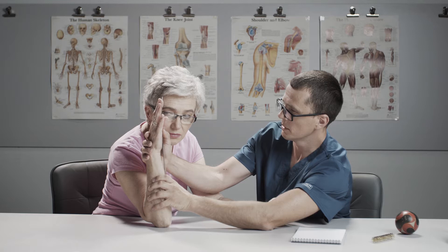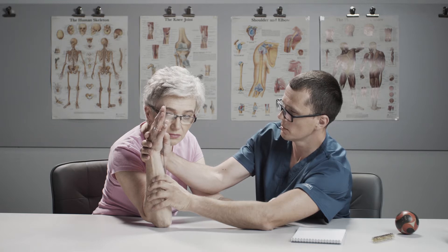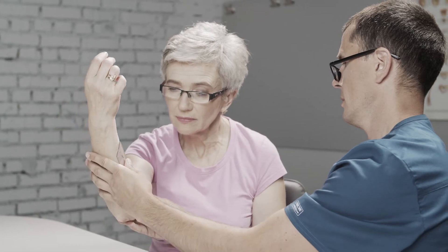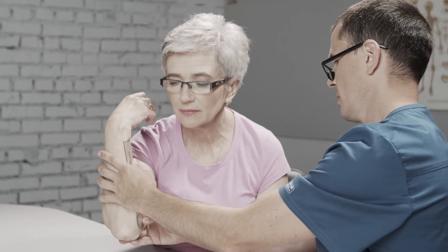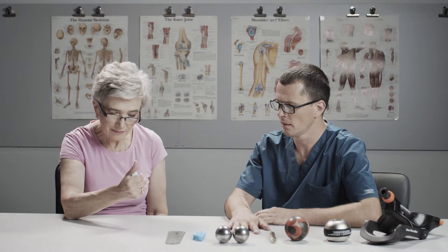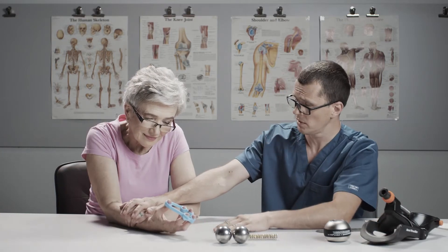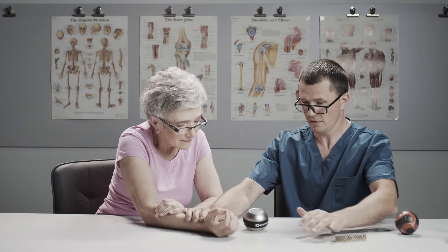The rehabilitation process can be very long and demotivating for both the patients and therapists. Endless manual examination tests, boring repetitive exercises, and uncontrolled rehabilitation when the patient is at home. This results in many patients dropping out from the course in the middle, often without much improvement for their disabilities.